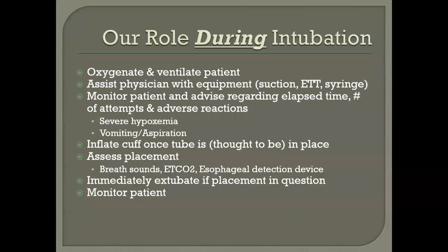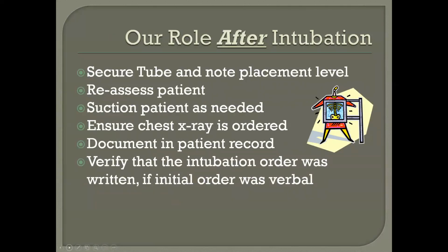Watch for the SATs dropping precipitously, if it was a blind intubation, or if the belly's getting bigger, because you're listening over the lungs and you're also listening over the belly. So if you hear gurgling sounds over the belly, no bueno. And monitor your patient overall. After intubation, secure the tube, note the placement, and reassess the patient.